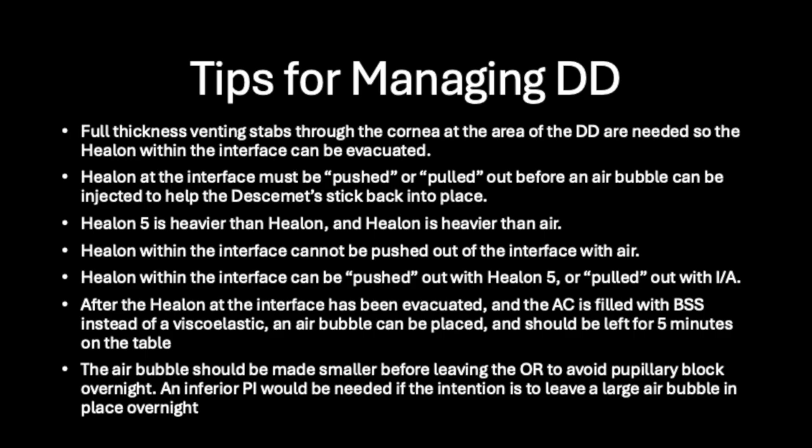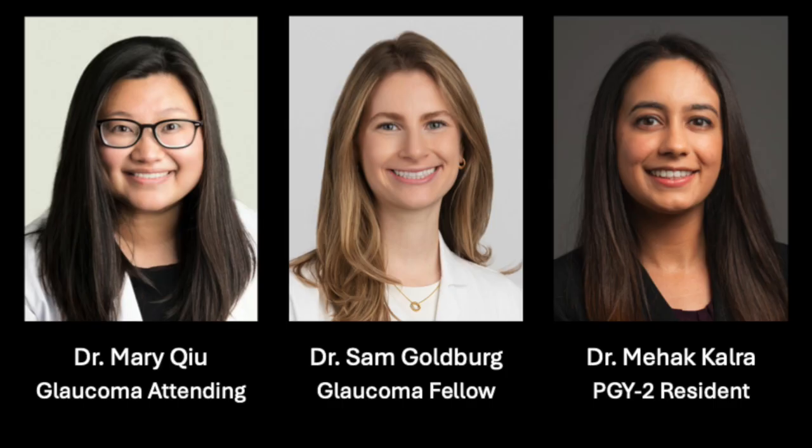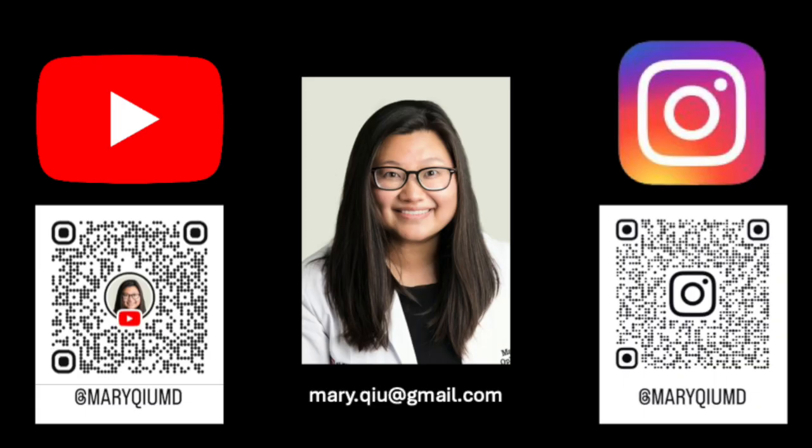After the helon at the interface has been evacuated and the AC is filled with BSS, an air bubble can be placed and should be left in place for five minutes on the table. The air bubble should be made smaller before leaving the OR to avoid pupillary block overnight. An inferior PI would be needed if the intention is to leave a large air bubble in place. Thank you so much for watching our video. We hope these tips will make you feel more confident in handling the rare but still possible intraoperative complication of Descemet's detachment during viscocanaloplasty.